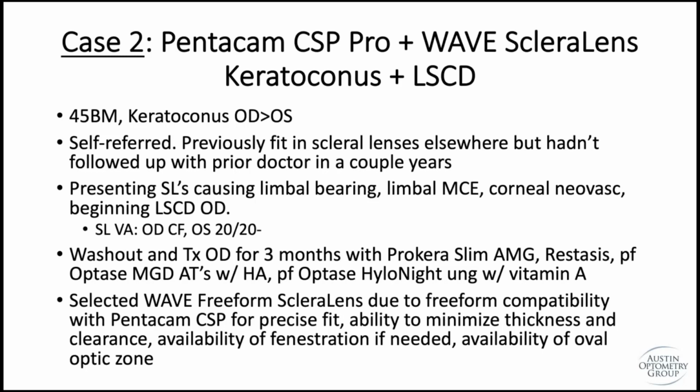Of course, you can make it thicker or thinner, but generally it will give you more or less the thinnest lens that's structurally good for that design. That's my personal preference as far as oxygen transfer. I also like typically lower clearance lenses with a freeform design. I feel like you get a little bit more predictability in the settling than you do in some more traditional designs.